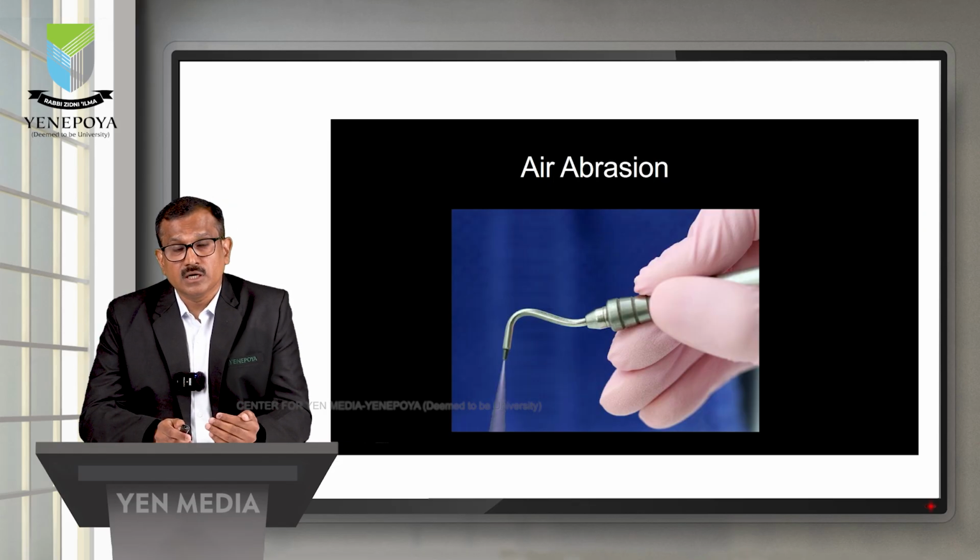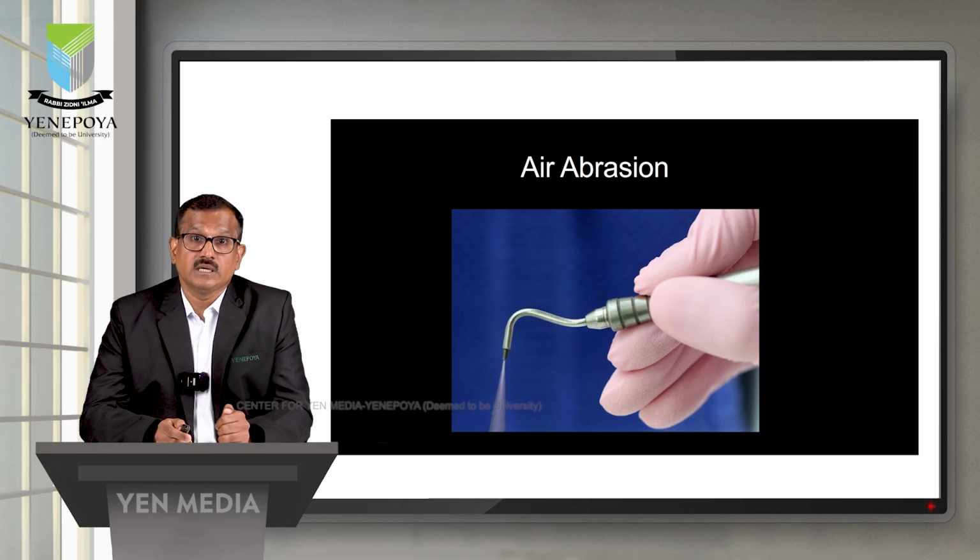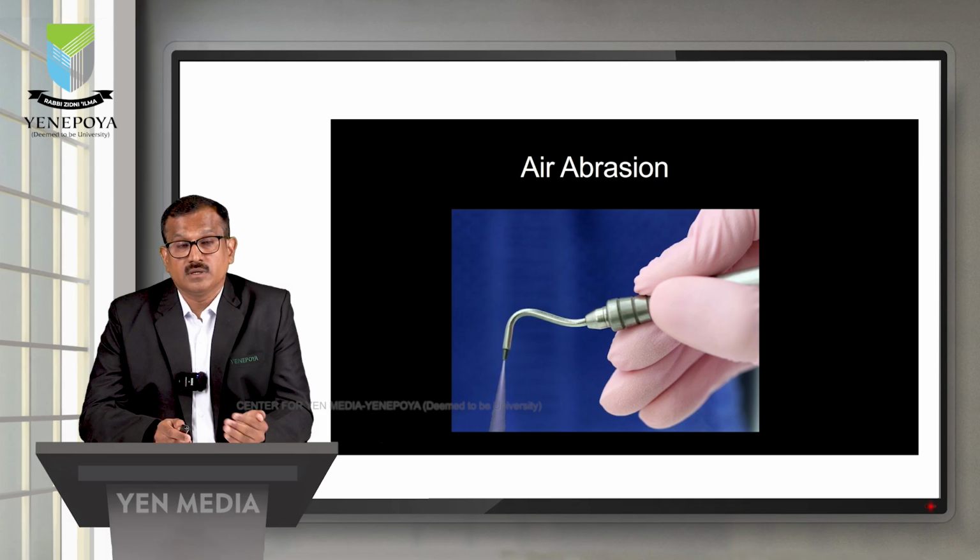So now we need not prepare much. Though hard tissue lasers are also being used nowadays, because of their expense they are not widely used in this part of the world. So let us hope that the day will come when all those laser techniques are available, wherein only what is required will be removed and the rest immediately sealed with resin materials, finishing the procedure within no time.